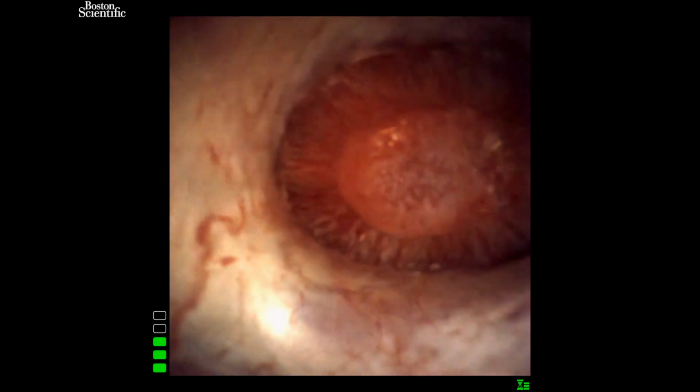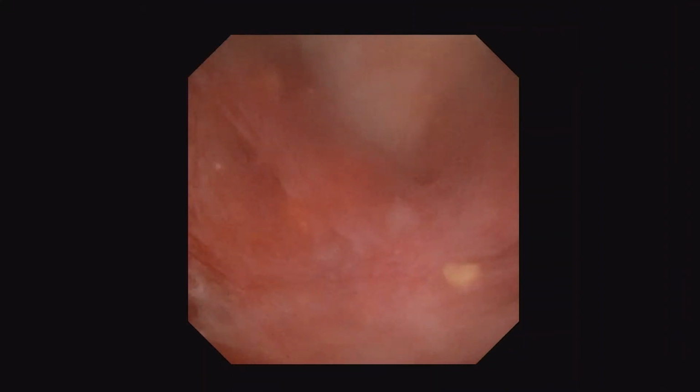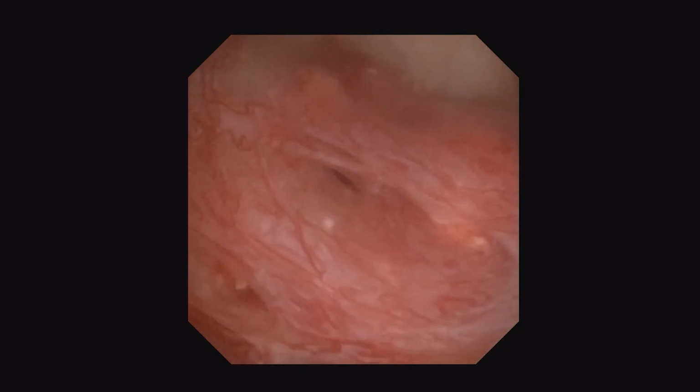And one way that we might be able to do that would be by what we see inside the kidney. I really can't take credit for this idea. I was inspired by my fellowship mentor, Dr. Jim Lingeman. It can be very obvious when you start looking at the renal papilla that not all patients are the same.